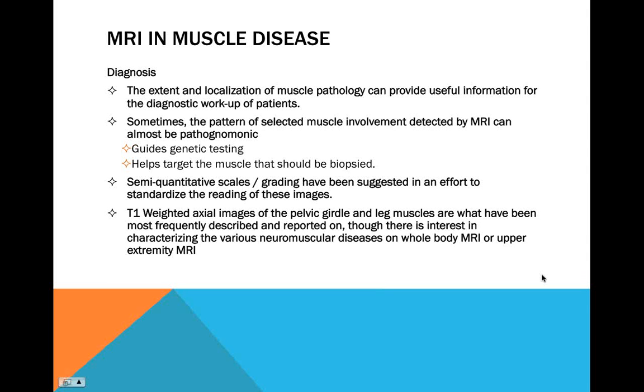So what people have been trying to develop are some coils that aren't those large bore coils, but coils that are specific to going around the limbs. But these are all experimental and probably very, very expensive to buy, which we don't have access to right now. That's another area where muscle ultrasound actually can be superior as well, because it's really easy to get arm imaging.